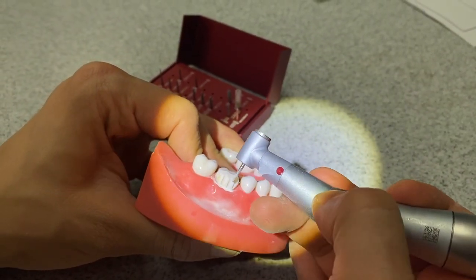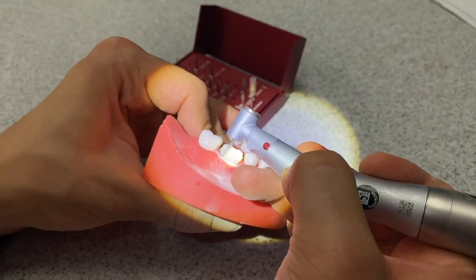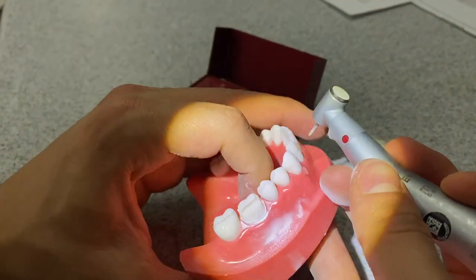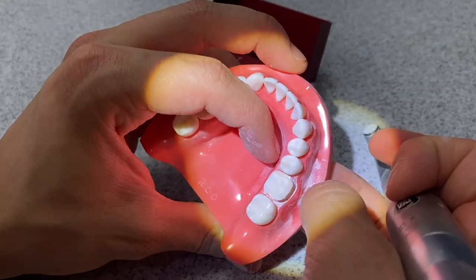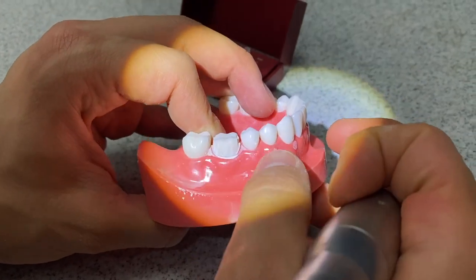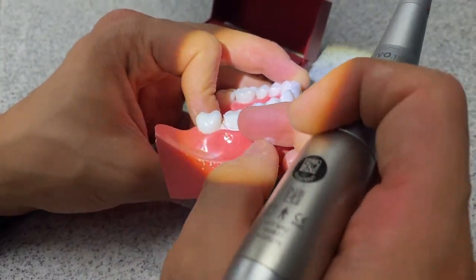It's going to be super important that as you're connecting them, you're focusing on maintaining that finish line. Remember we want it to be a 0.5 millimeter chamfer. At this point I have connected all of them. I can look at it from the occlusal to see that I do in fact have a finish line. It's not the smoothest, but that's okay — we're going to come back. Remember, refining is a later step. Right now we want to be as fast as possible. We're going to move on to the lingual side and do the same thing — depth grooves, connect them — then we'll move into the interproximals and then the final step: refine everything.